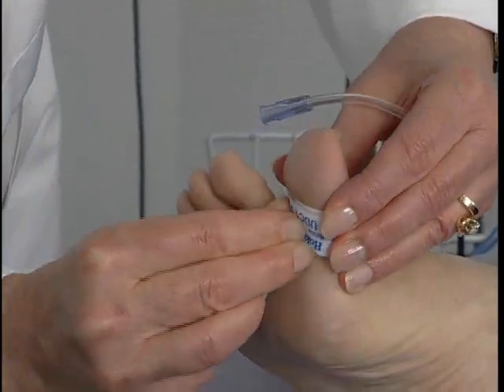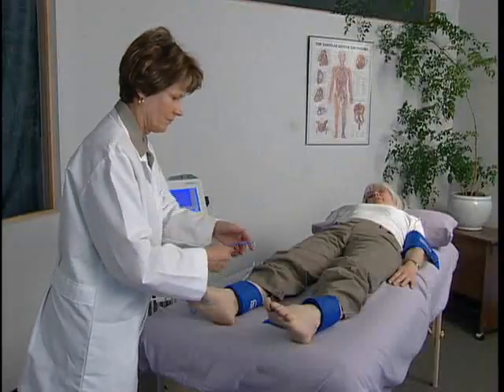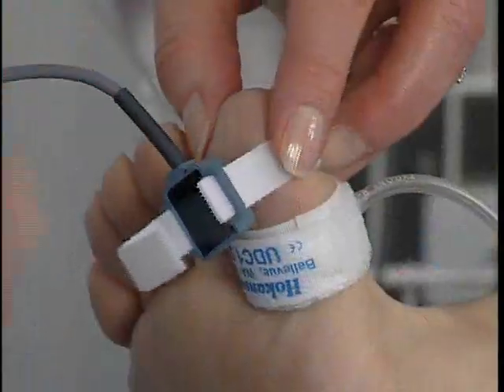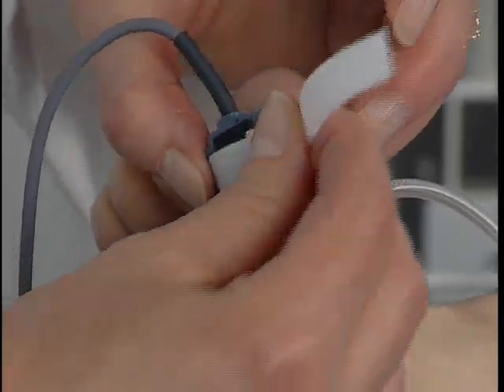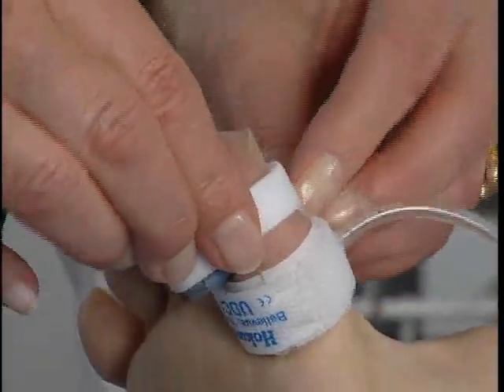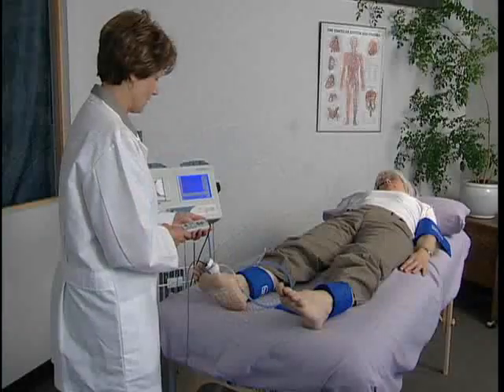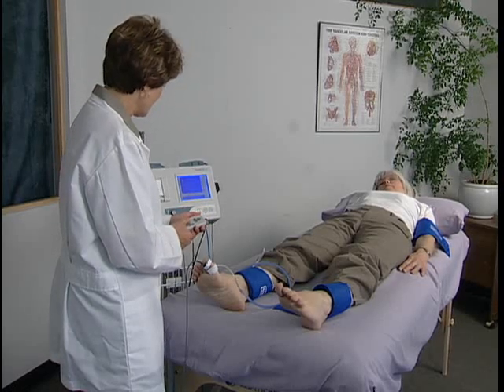Wrap the digit cuff around the base of the great toe. Move the hose from the ankle cuff to the digit cuff. Attach the PPG probe to the toe distal to the cuff with the blue side of the probe against the skin. Again, the probe should be snug but not too tight. The patient must be still. Wait several seconds for the waveform to stabilize.